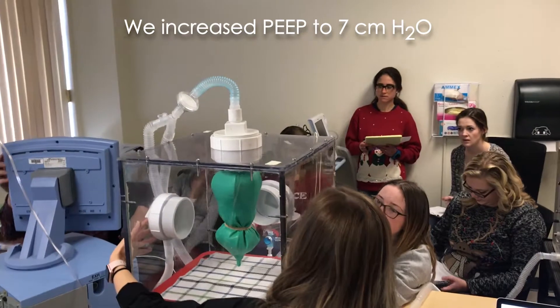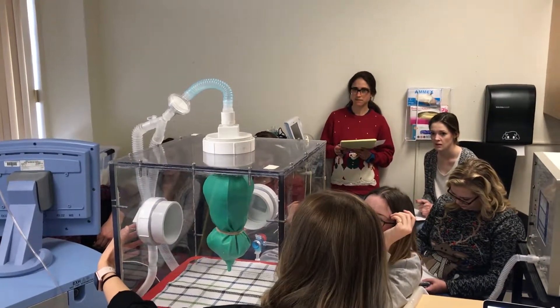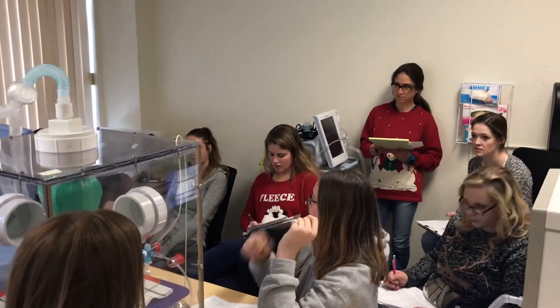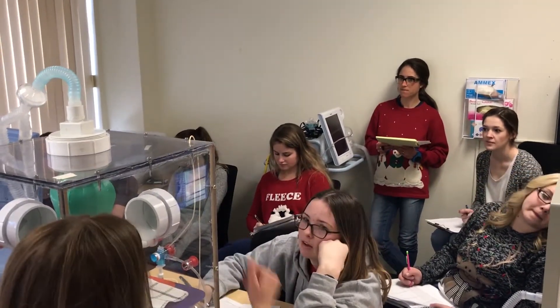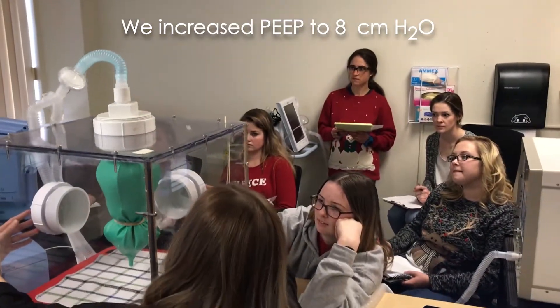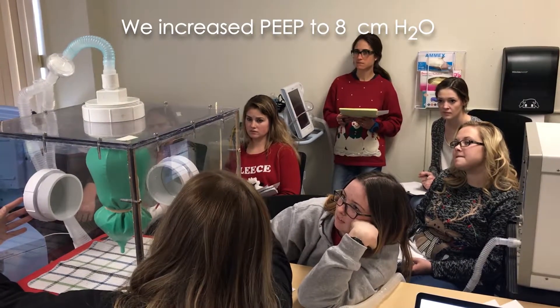Give it just a minute and it'll be all right. Nobody reset it. Rubber bands — I know they're kind of falling down there. Okay, there we go, that'll do. Should we see what eight does? Uh-huh.